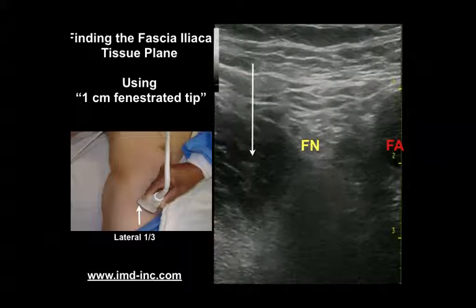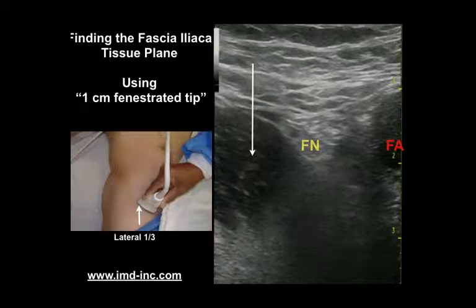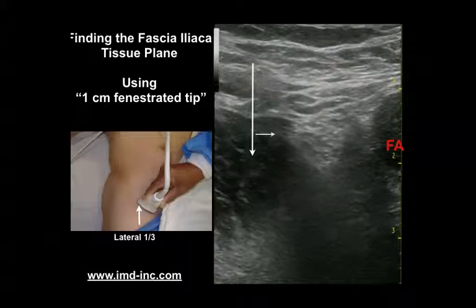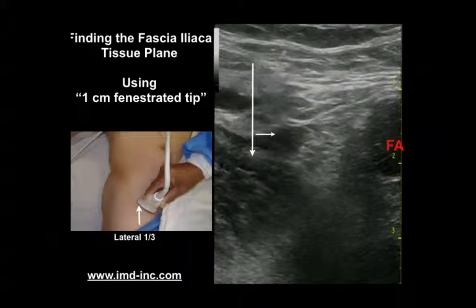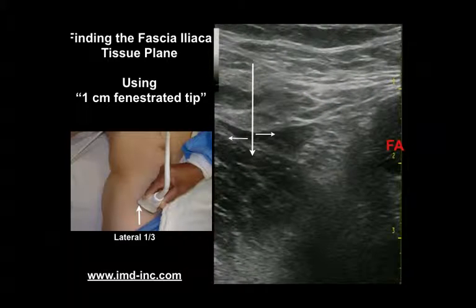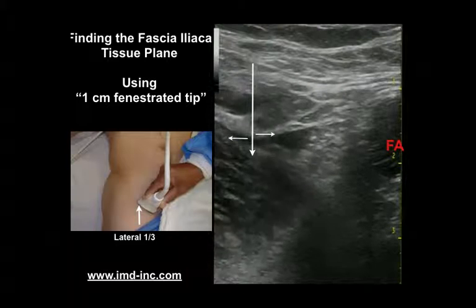local anesthetic, some of which, after we tent through, will in fact exit superficial to the desired plane, but the vast majority of this local anesthetic exits in the plane deep to the fascia iliaca, or in the correct fascial plane.